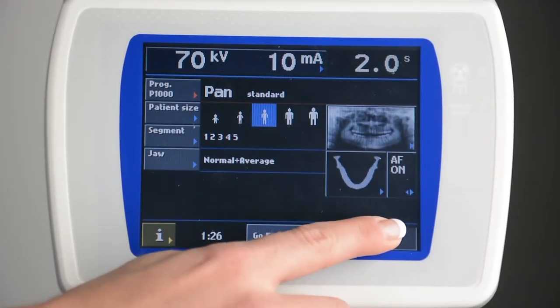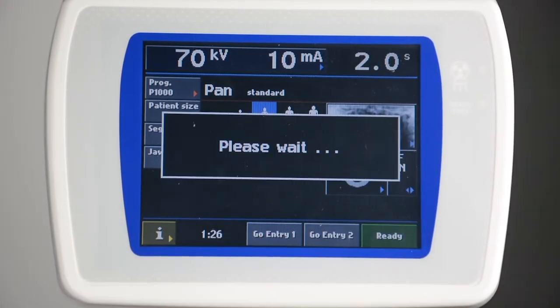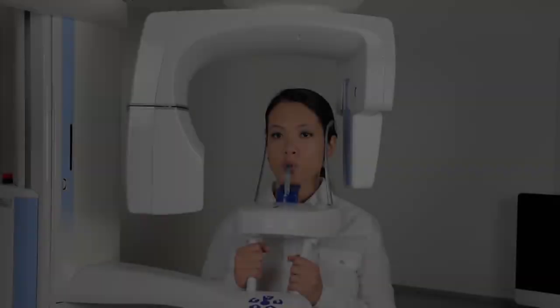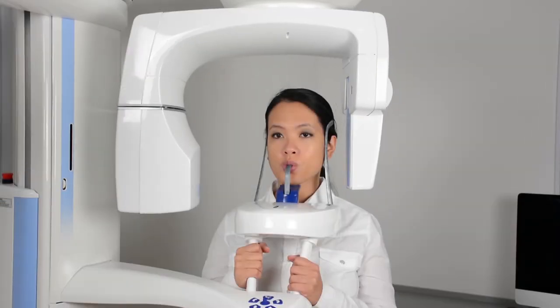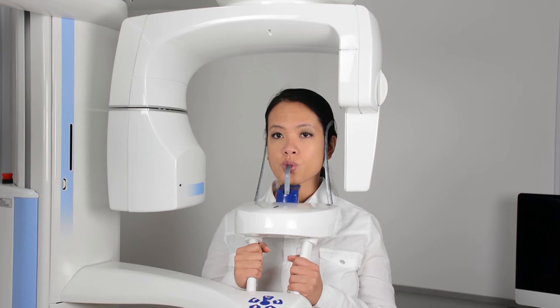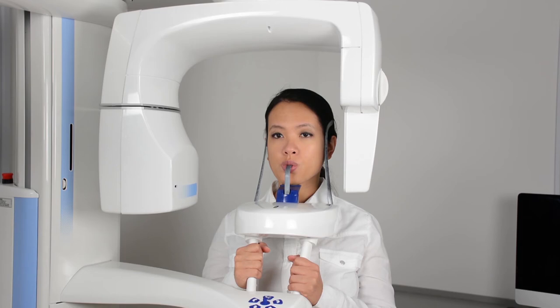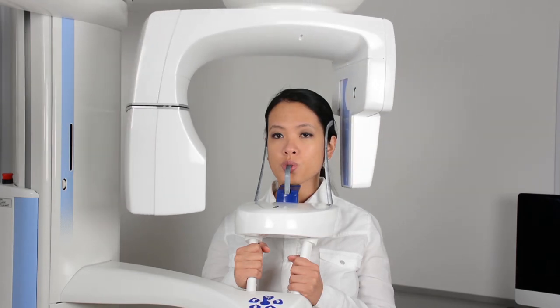Then press Ready. Hold down the exposure button until all audible noises cease. While autofocus is processing, instruct the patient to remain still, close the lips, swallow, and suction the tongue to the roof of the mouth.